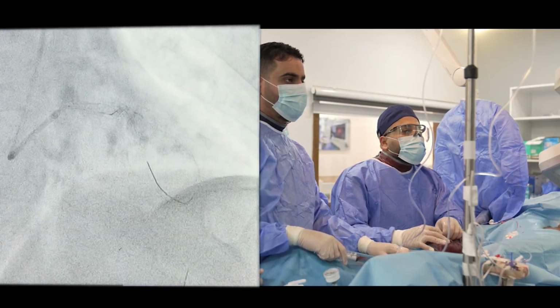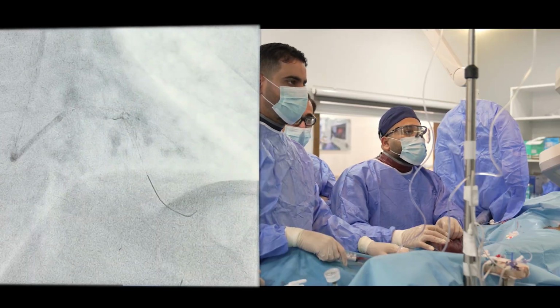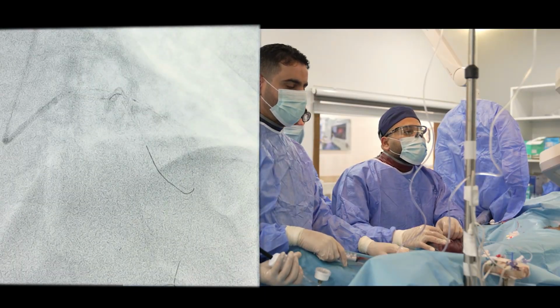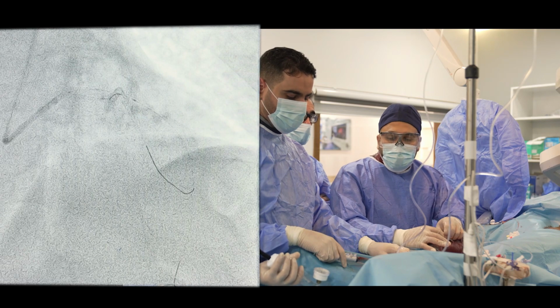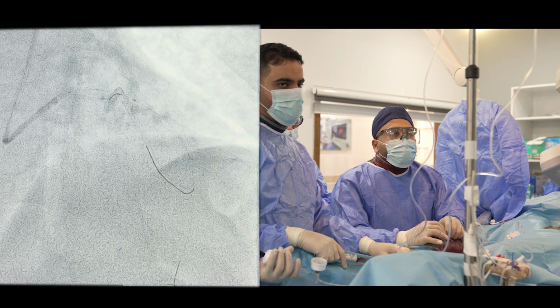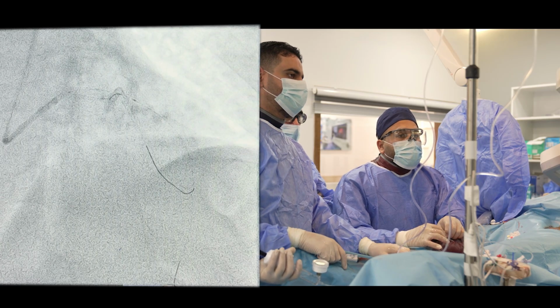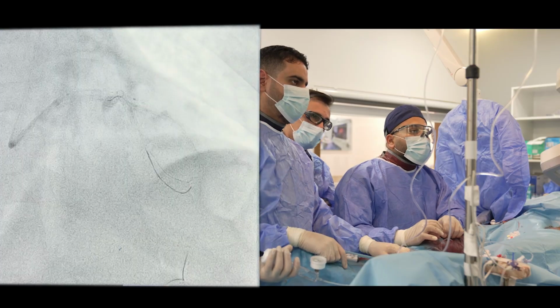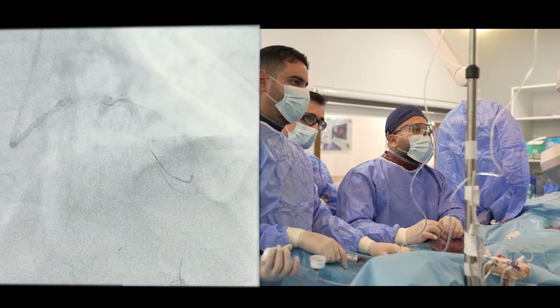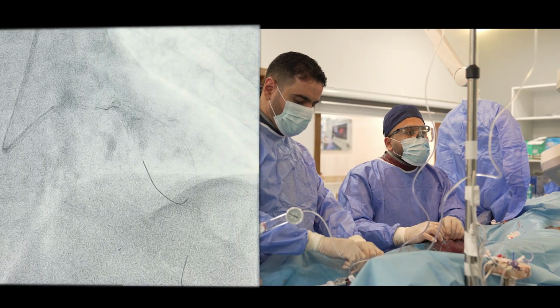So it's important to do the inflation twice so that the balloon will take its real size. Otherwise, there will be some under expansion. Now it's okay. The pressure came down and is recovering again. Okay. Pull out the balloon. You may see some difficulty because it's a large balloon. I say it's good. Okay, take it out.